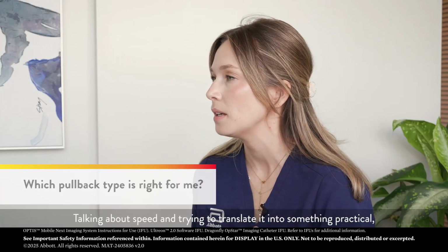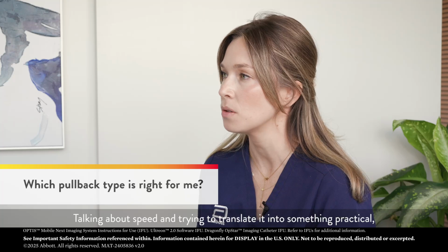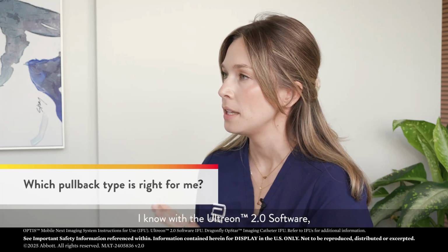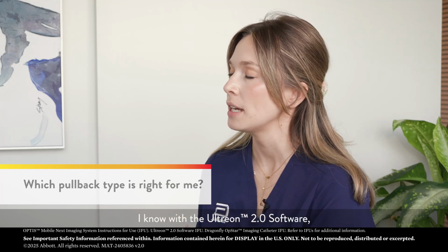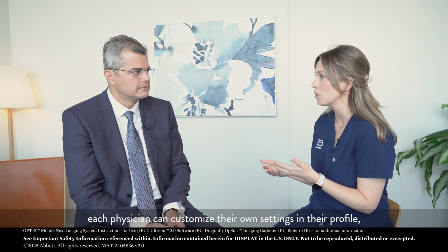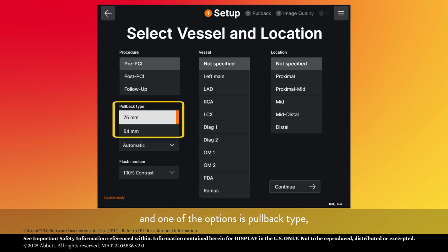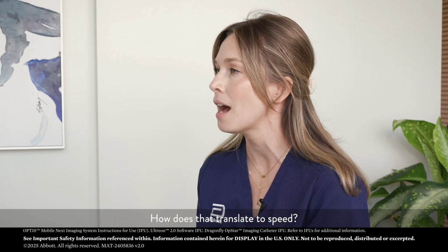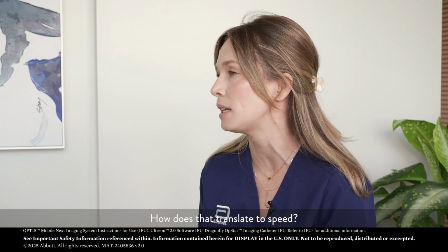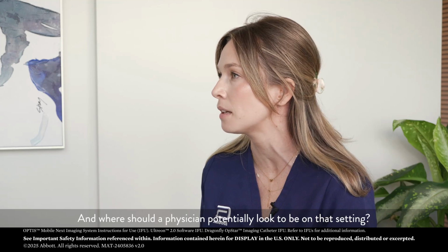Talking about speed and trying to translate it into something practical, I know with the Ultreon 2.0 software, each physician can customize their own settings in their profile. And one of the options is pullback type, and it gives you the option of 75 millimeters or 54 millimeters. How does that translate to speed and where should a physician potentially look to be on that setting?